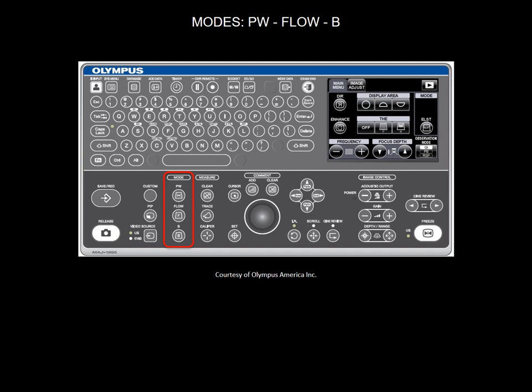The flow mode helps you maneuvering and avoid blood vessels during tissue sampling. And the PW, or pulse wave Doppler mode, it helps you differentiate between artery and vein.